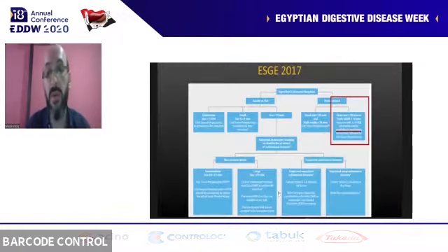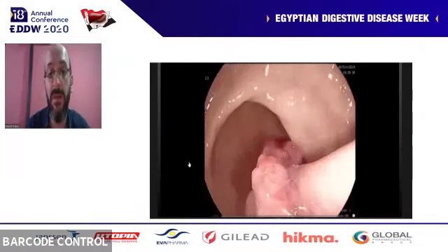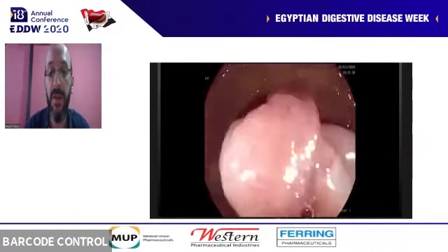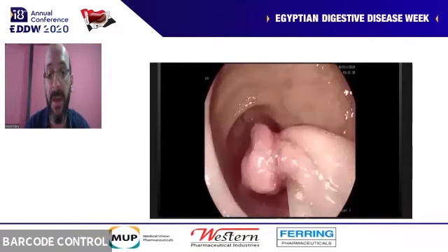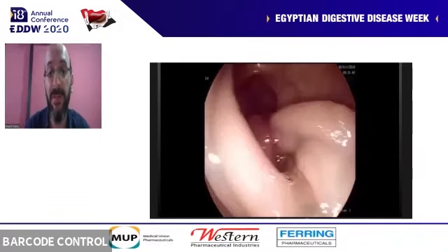Moving to more difficult polyps, we can see here polyps which, according to the guidelines, are more than 20 millimeters, or have a thick pedicle or stalk of more than 10 millimeters. So it's better to use a combined technique. Following injection, we use either an endoloop or a clip to prevent bleeding from this polyp.